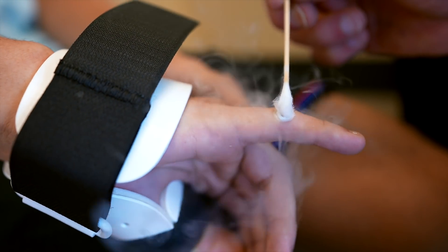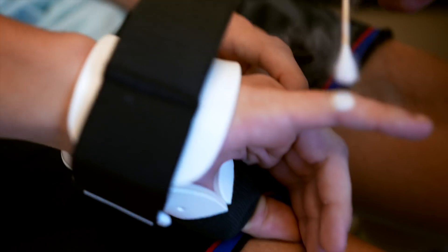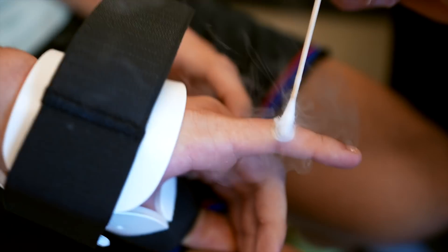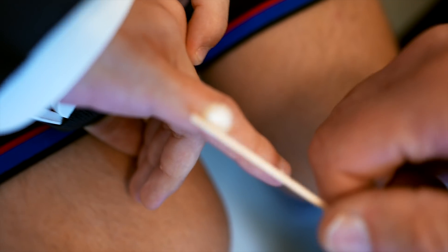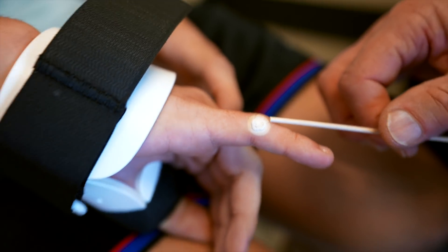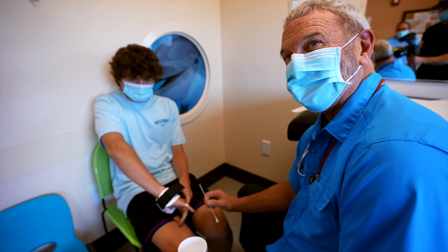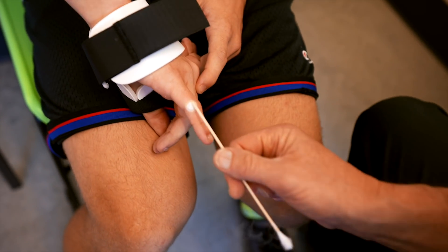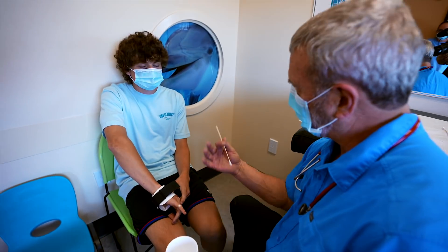We want at least a millimeter of normal tissue frozen. We're all done — one last time. This is a good freeze. Now sometimes when you do a really deep freeze like this — I mean, you can see I've got at least a millimeter all the way around — sometimes this area that got frozen will get kind of blood blistery. If that happens, don't panic, don't pop it. That's more blood flow getting around this wart, which is a viral infection, and the more your body's immune system is interacting with that virus, the more it's knocking it out.